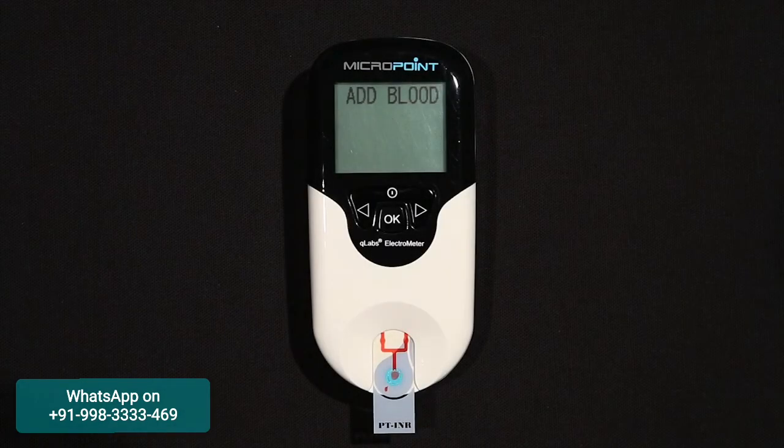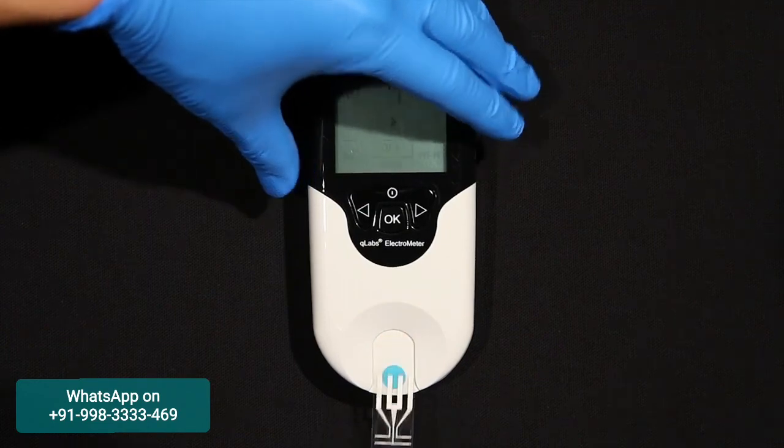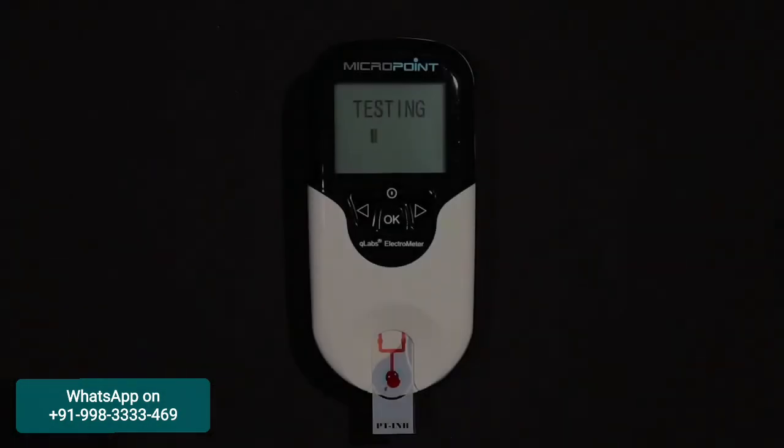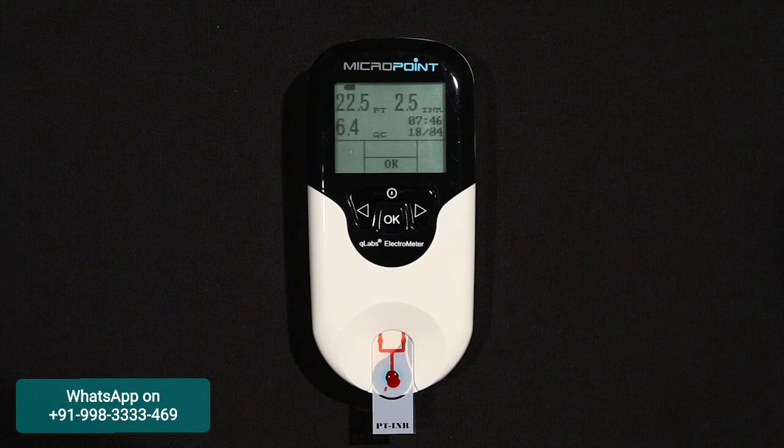After the blood sample has been added, the Q-Labs Electrometer will perform the test automatically. If an insufficient amount of blood has been added, the unit will continue to display the prompt to add a blood sample. If this occurs, remove the test strip and start the test over with a fresh test strip. When adding a blood sample or testing, do not move or touch the Q-Labs Electrometer. The unit will beep and the test results will appear on the screen, along with the date and time when testing is complete.